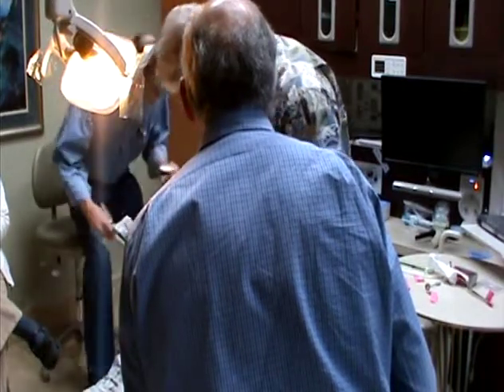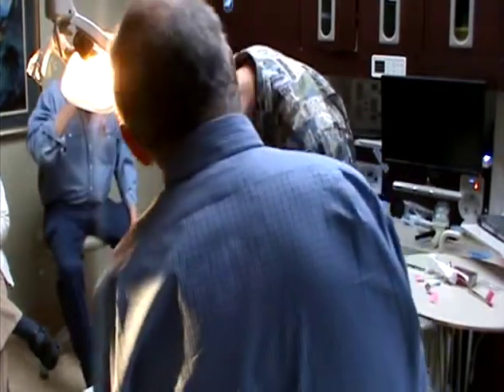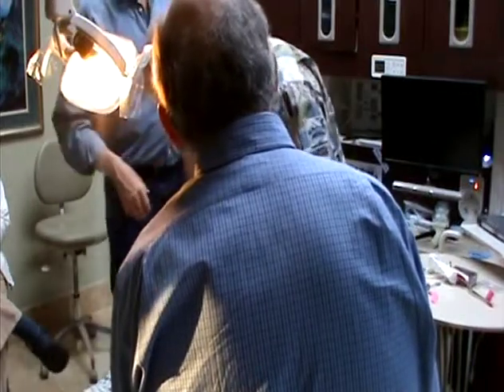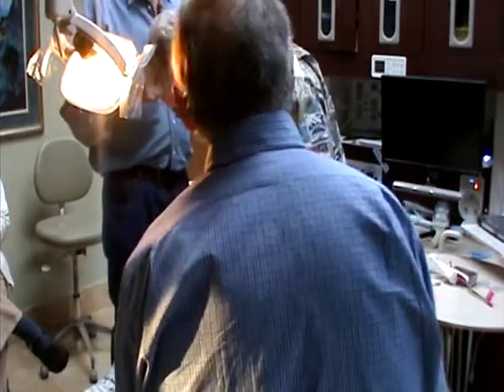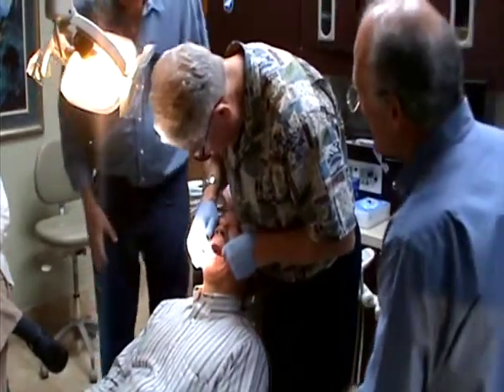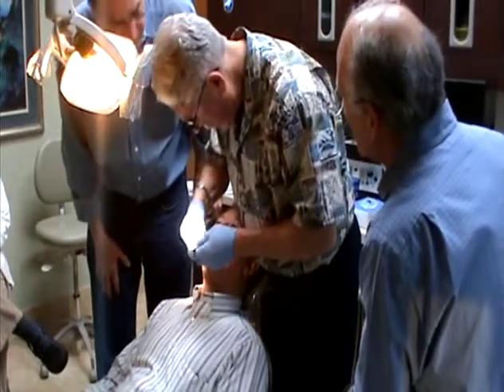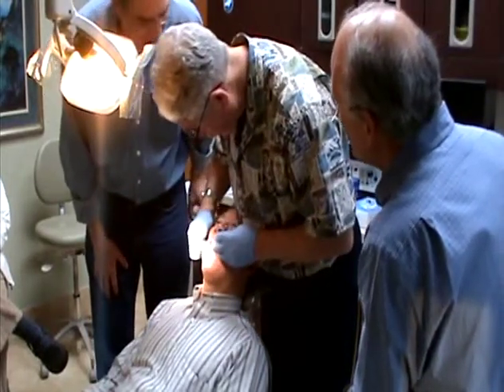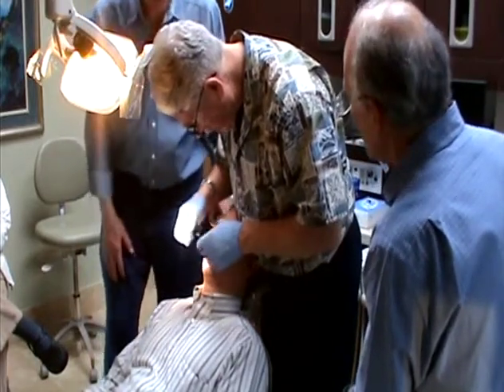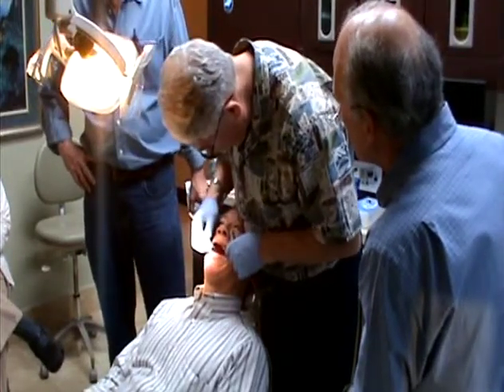Well, you're not going to get any real bite interferences out of that. You've got those built up already. What's going on with the second molar? It's got a big buildup on it, and I'm wondering if that should be cut off right now. You've got a big buildup on this one, way in the back there.